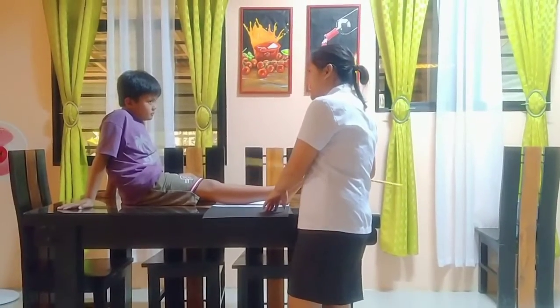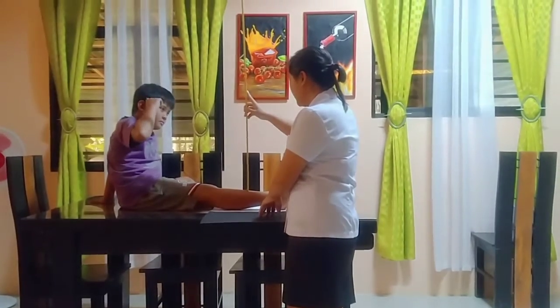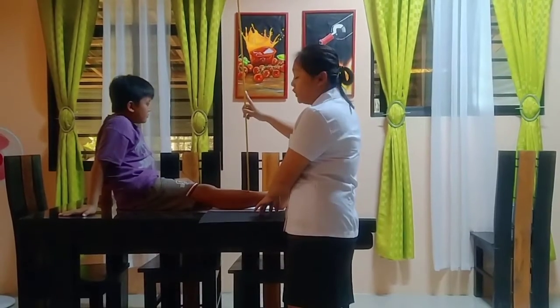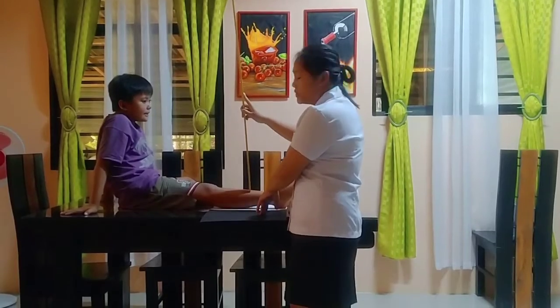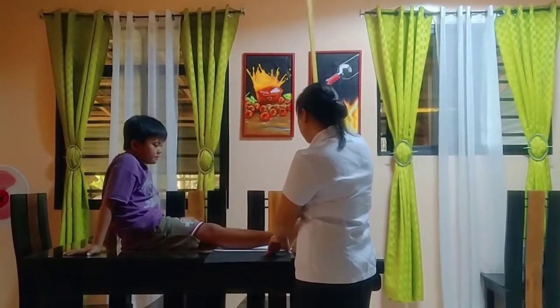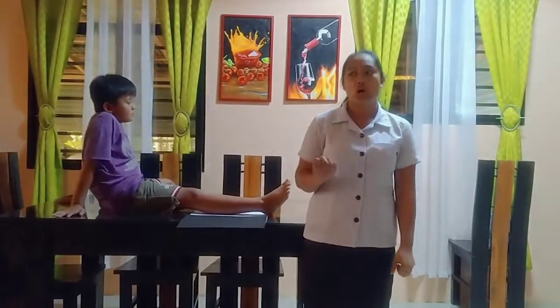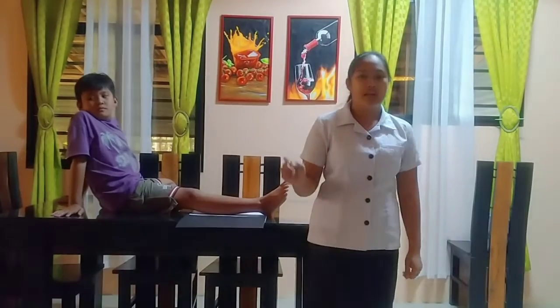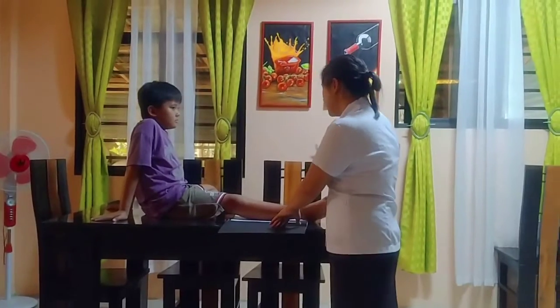Now, the central ray will be perpendicularly directed at the midpoint of the IR. So, yan po. Okay. Next, this projection shows the distal part, tibia and fibula, and also the interosseous space proximal to the tarsal bone.